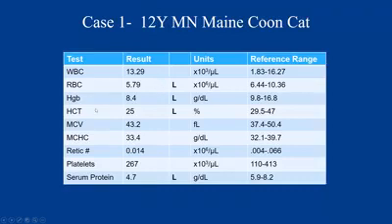Our three red cell parameters, so red cell count, hemoglobin, and hematocrit, are decreased. All right, so we have an anemia in this patient. We're going to ignore MCV and MCHC right now, which correspond to red cell size and hemoglobin. Again, not the focus of this talk, but those were within reference interval.